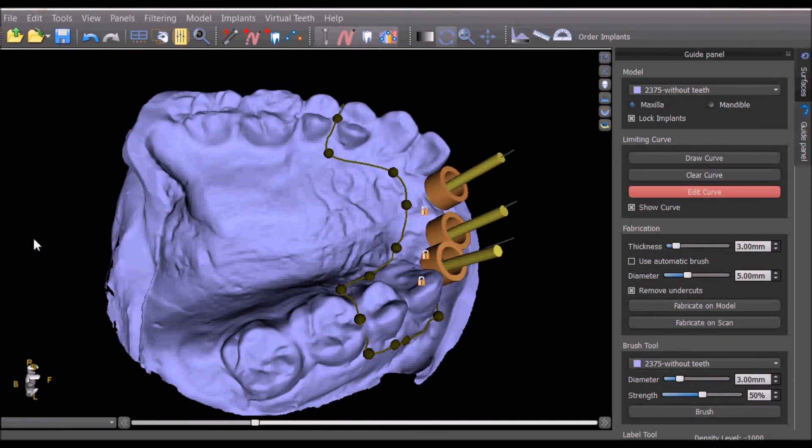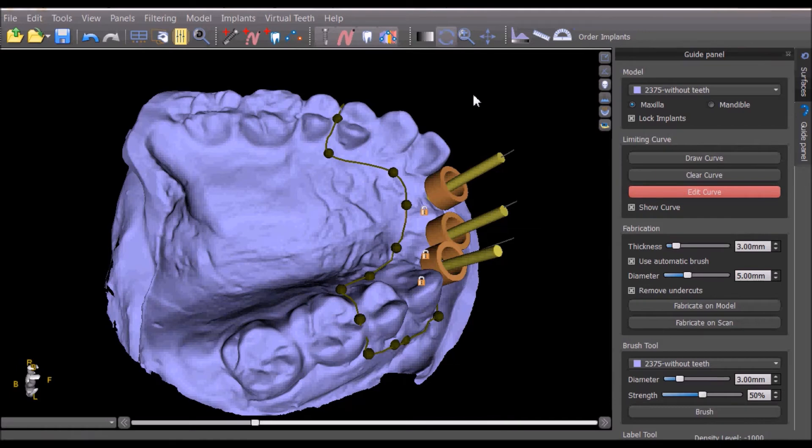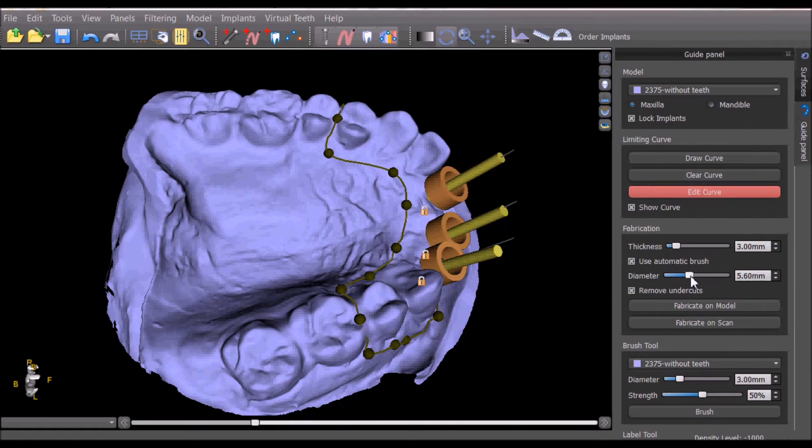Once the curve is properly drawn, we can decide if we want to remove the undercuts and if to use an automatic brush, which increases the access to the holes in the surgical template by clearing a circle around the hole in the template according to the diameter defined.